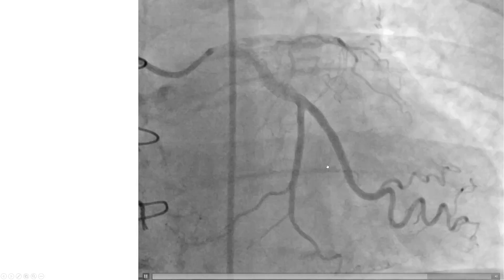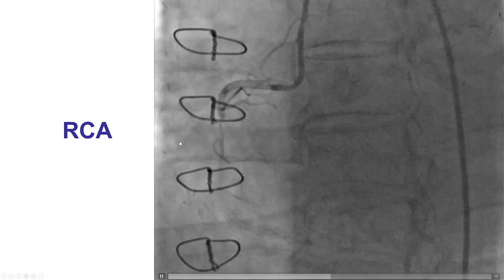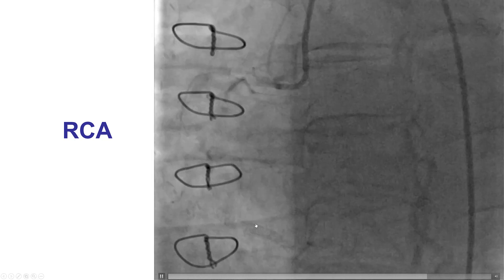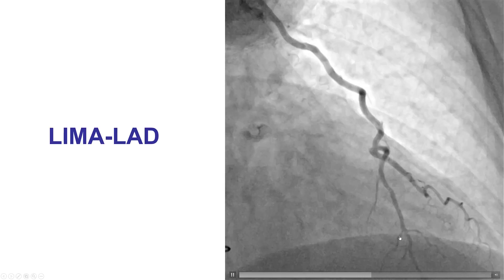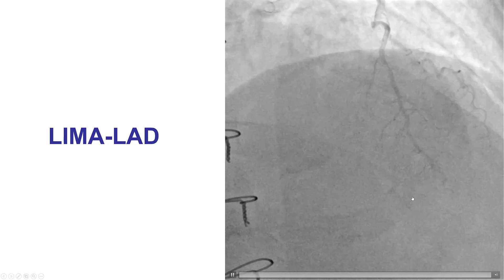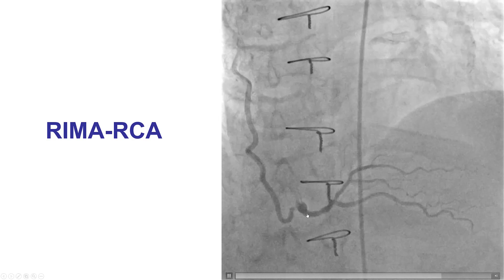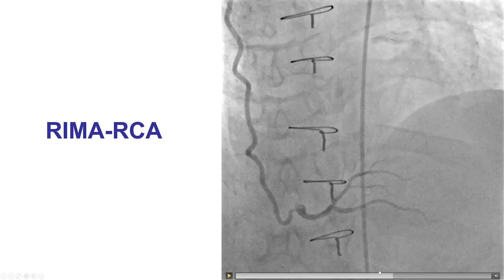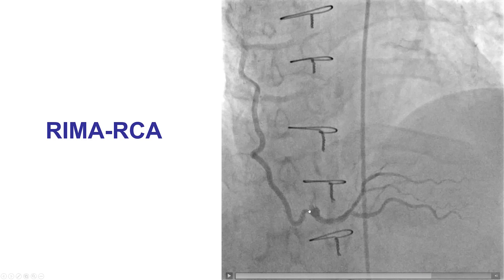Diagnostic angiography showed no significant disease on the circumflex. The LAD was a CTO as known from before. The right coronary artery had a high-grade lesion in the mid-segment, but there was some antegrade penetration of contrast. The LIMA was normal, supplying the left anterior descending artery. The RIMA was also patent; however, there was an area of haziness at the touchdown to the distal right coronary artery, which appeared to be the culprit lesion right at the touchdown of the RIMA graft.